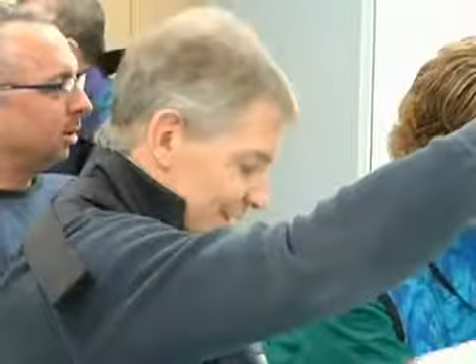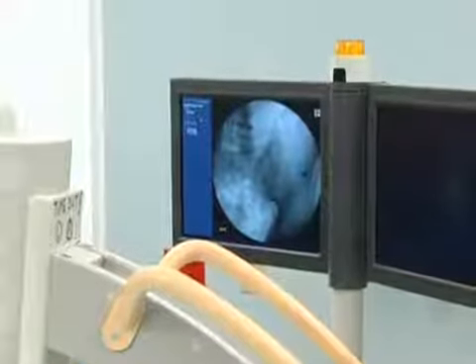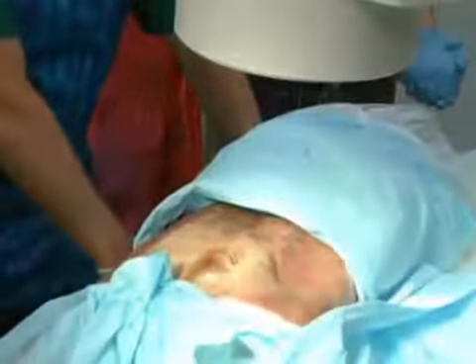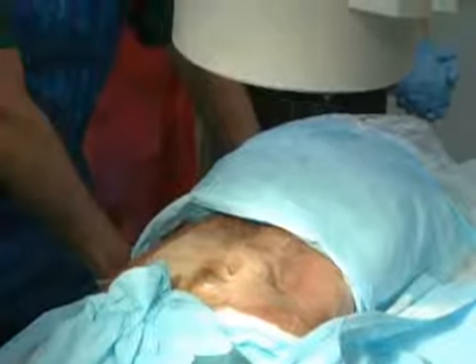Let's start with what we would do. So let's see an AP. We're going to oblique just a little bit to get a true AP view. Okay, and center your target, which we have, pretty much vertical. The patient's body is in their standard prone position, with a pillow underneath the abdomen. Because the sacrum curves away from you, we're already kind of in a line. I've tried a pillar view. I might go back to it, but this is what I found works the best.